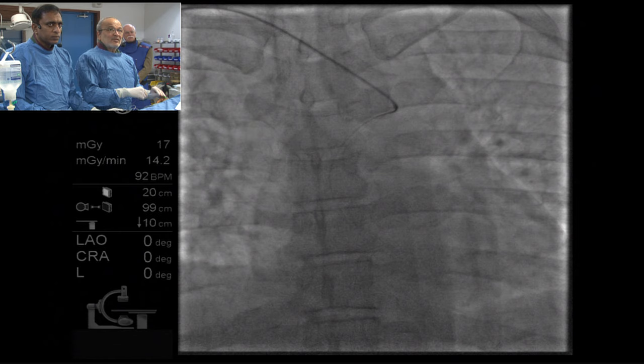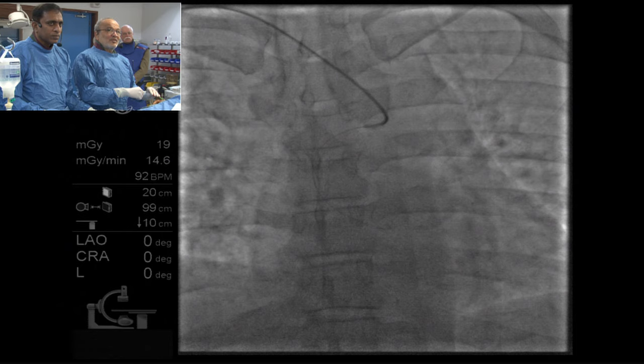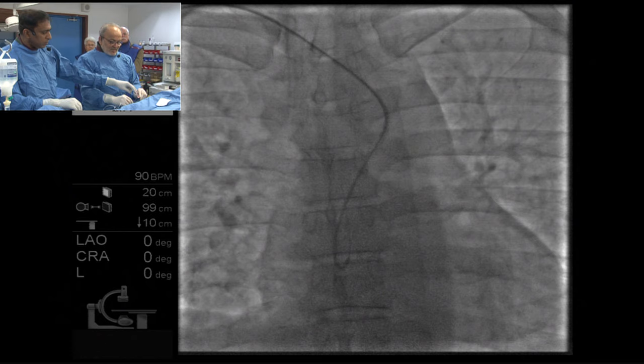As you know, arteria lusoria is why it comes to you. See, I am traversing my catheter very slowly. Now I am in business. Any specific wire or guide for arteria lusoria, or can we go with the routine?